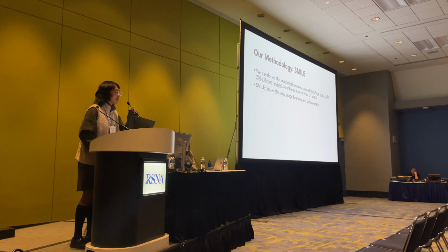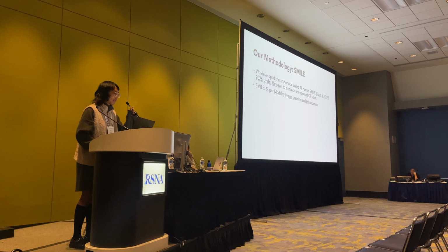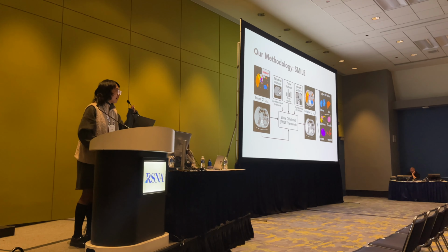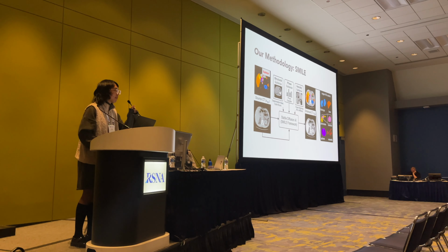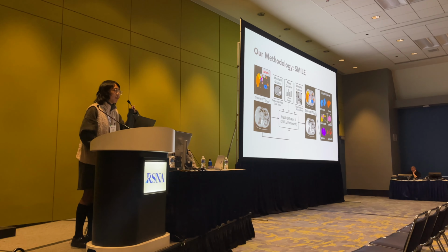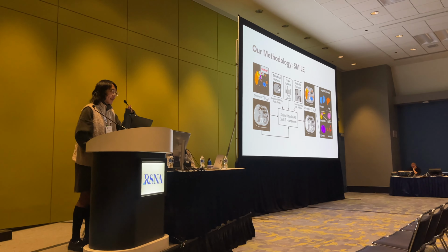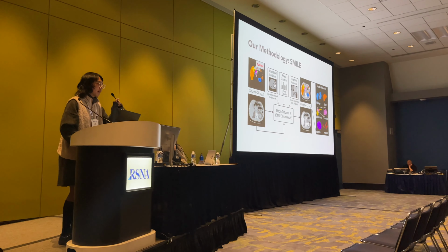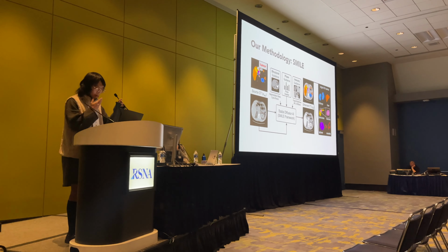Therefore, to address this, we put forward a method called SMILE, an anatomy-aware AI to enhance non-contrast CT scans. The full name is Supermodality Image Learning and Enhancement. This plot illustrates the pipeline of our system. It is based on the very popular Stable Diffusion generative AI framework, and we introduced 3 specific parts, that is structural, phase, and intensity guidance, to complete the enhancement task.